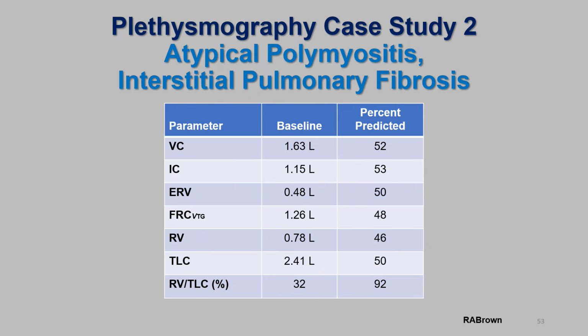This subject, a 53-year-old female, 63 inches and 188 pounds, was referred for evaluation because of her complaint of increasing dyspnea both at rest and during ambulation. Inspiration chest radiographs showed reduced volumes that were confirmed by actual static lung volume measurements. Note the near symmetrical reduction in all lung volumes, which is a hallmark of a restrictive ventilatory defect. There was no evidence of airflow limitation with forced expiratory spirometry. Obviously, that's not shown. And at the time of this testing, this subject was undergoing lung transplantation evaluation.